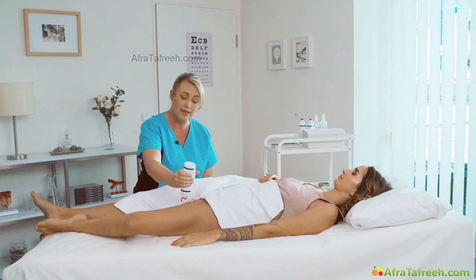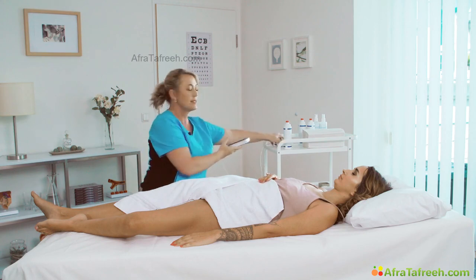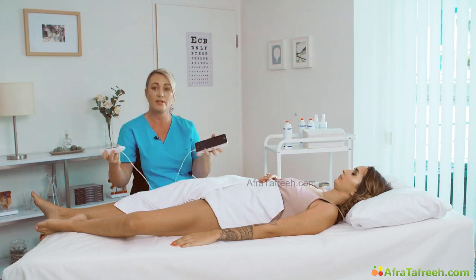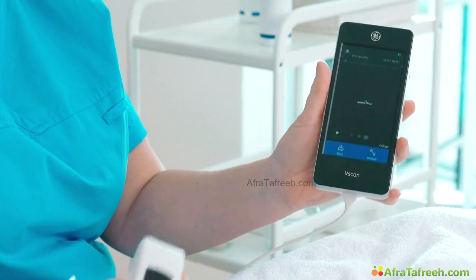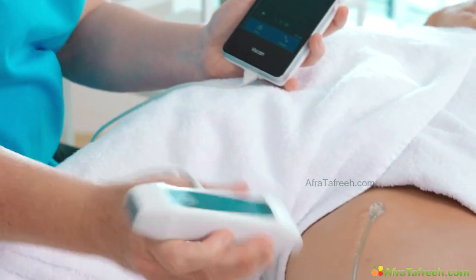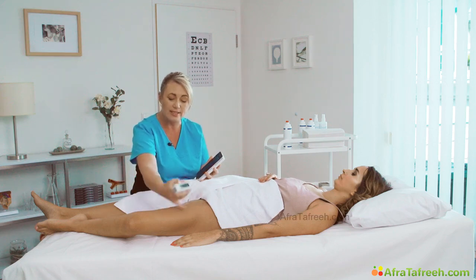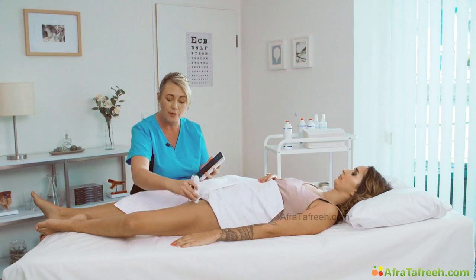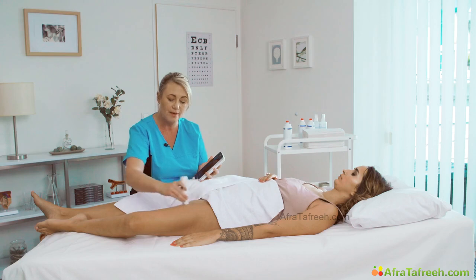Now we're going to prepare the leg ready for scanning. So we'll take the gel, place a small amount on the inner thigh, take our handheld device. It's already been selected for a vascular preset here. So our linear transducer is already selected. We're going to spread the gel. Imagine where the vein is lying in the leg. So it's in behind the femur. We're going to go from the common femoral vein right down to the adductor region. So we're ready to go now.